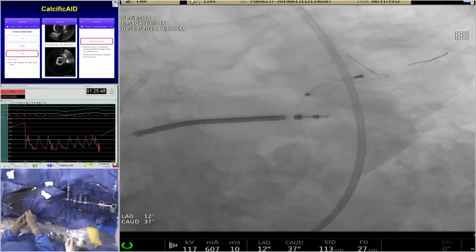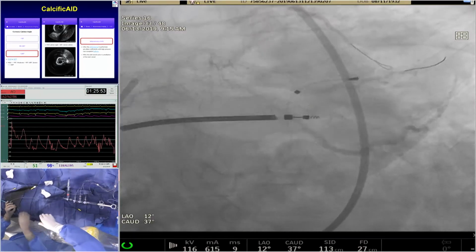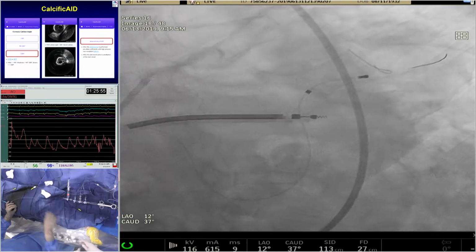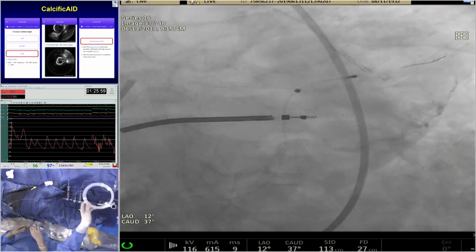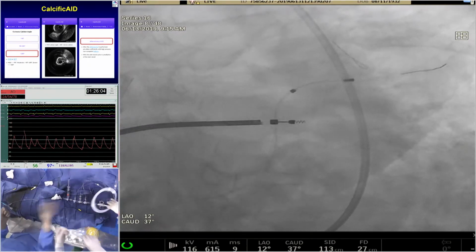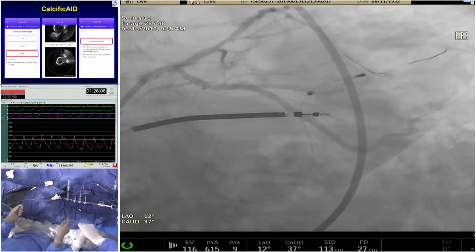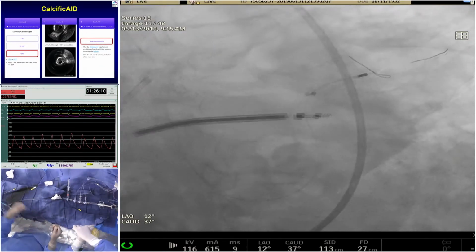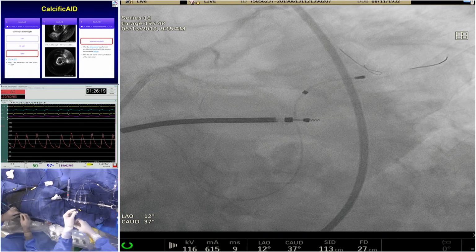Yeah, I would agree with trying to avoid the ostium of the circumflex. However, most of the time when I balloon it and then stent over it, I end up putting the stent in the circumflex. So here's a case that I would actually say, given what I'm seeing, two large vessels, both calcific, and the circumflex is diseased even just beyond the ostium. You're going to have to do something in that circ. If we're here to do the best complete revascularization, I don't see any other choice but to do a dual stent technique with excellent imaging and final follow-up.